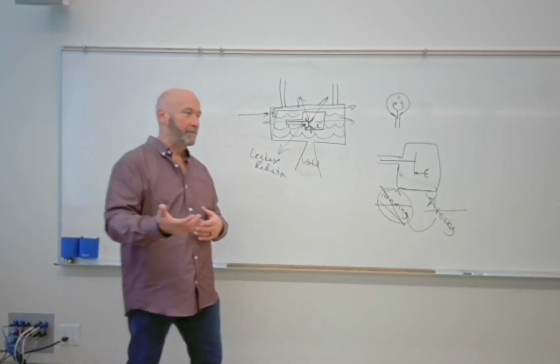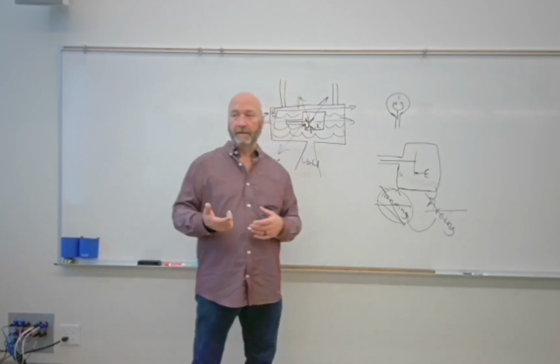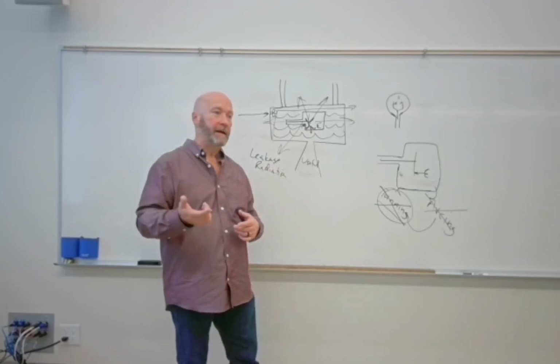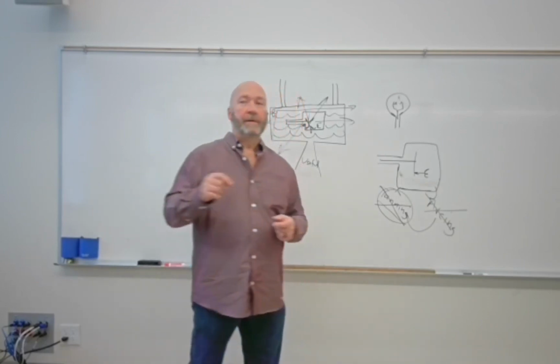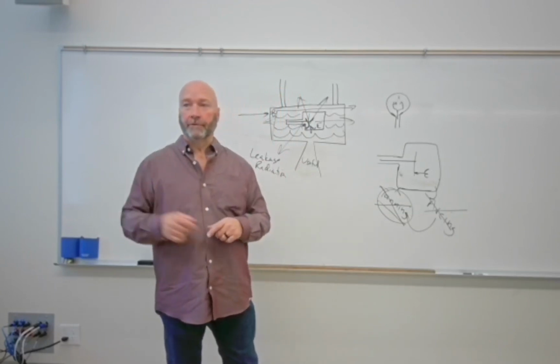What they've landed on is that if you're using a machine that creates X-rays at 70 kVp or above, you have to have 2.5 millimeters of aluminum equivalent. The word equivalent is a big word in this. It has to be 2.5 millimeters of aluminum equivalent filtration.